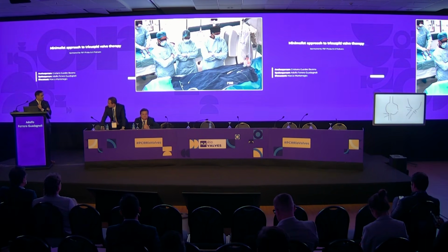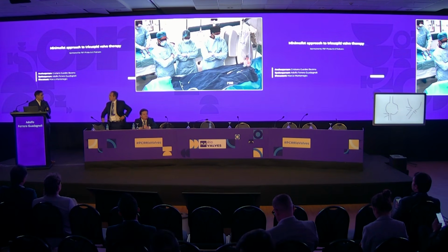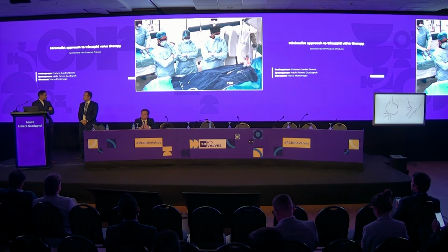The tricuspid was also repaired, but it failed. Yes, but now the patient is evolving badly, and now we have a torrential TR with a pacemaker lead. You did the right heart catheterization, and the patient has no contraindications to go ahead with a tricuspid procedure.